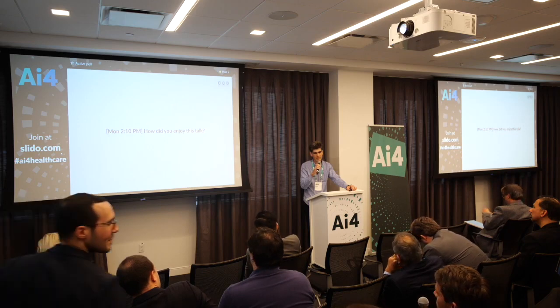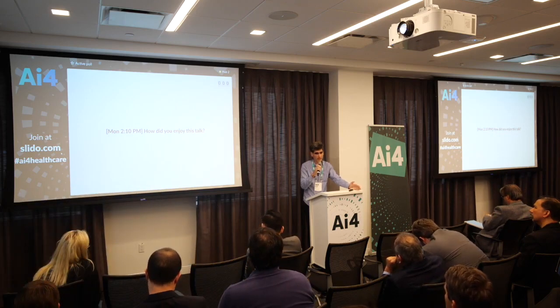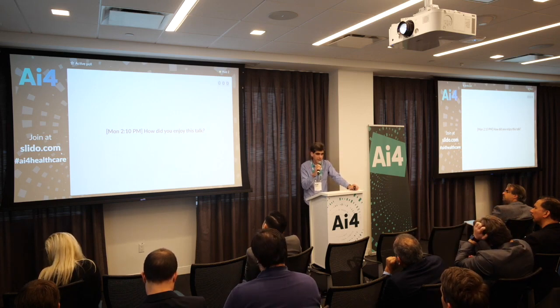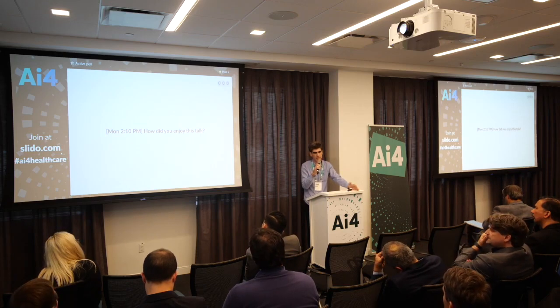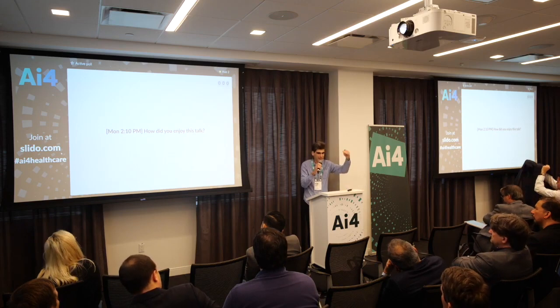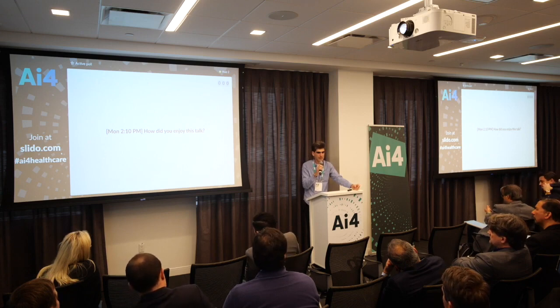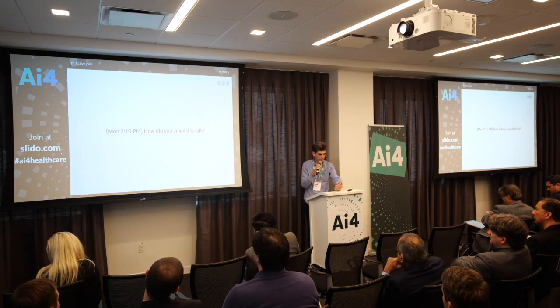Yeah, so it's not off the shelf, but we don't build them from scratch either, which means there's plenty of literature. The architectures that we used are based on well-known architectures, but it's not an off-the-shelf platform like Google AI or whatever. We work with Keras and TensorFlow. We don't write the layers ourselves because there's no need, but there's lots of nuances and details that go into the network architecture and the ways you try to overcome overfitting and issues such as that.